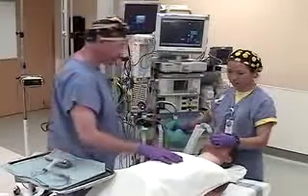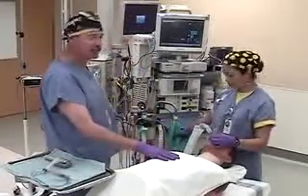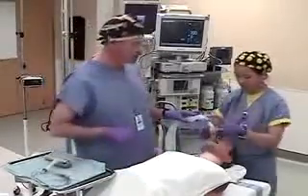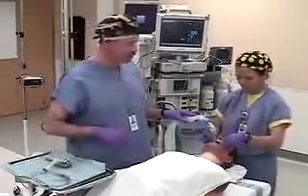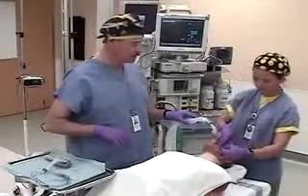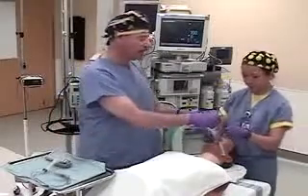Adequacy of ventilation is then checked by watching the chest rise and checking end-tidal CO2. The Proseal LMA is then taped in place. And then the bougie is removed.